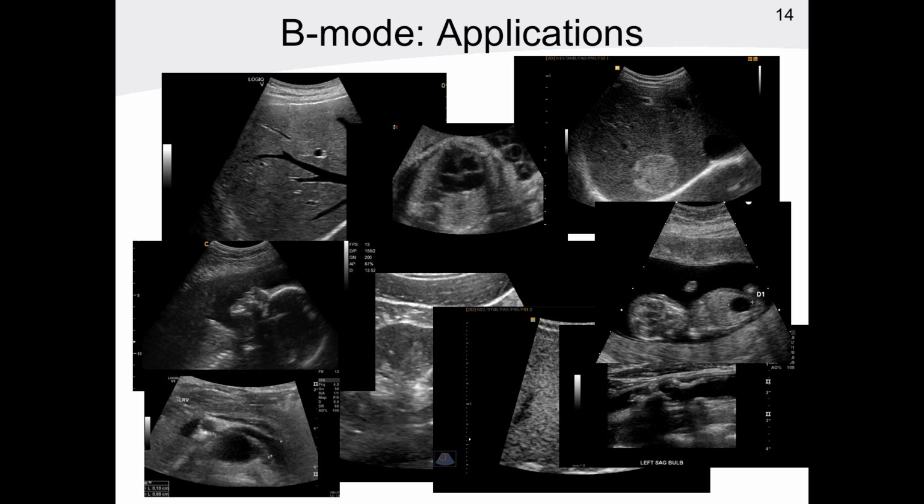What are the applications of B-mode ultrasound? Well, to be honest, there's way too many to name. They range from guiding an anesthesiologist placing a peripheral nerve block, to monitoring the development of a growing fetus, to identifying cancerous tumors in the liver. The important thing for us to remember and recognize is that the ability to look into the body non-invasively makes B-mode ultrasound a very powerful and very ubiquitous diagnostic tool.